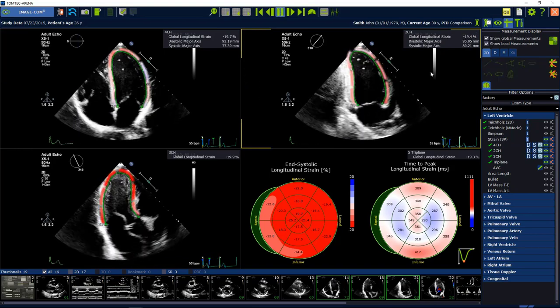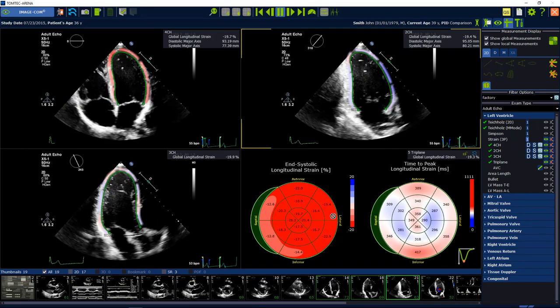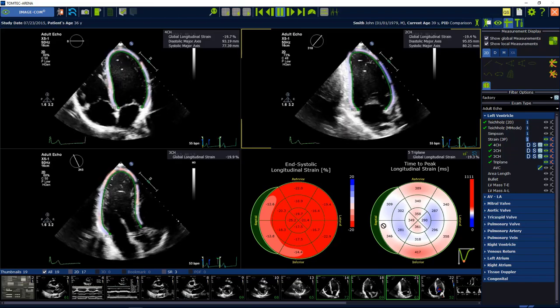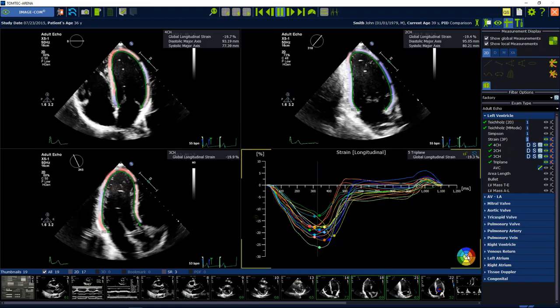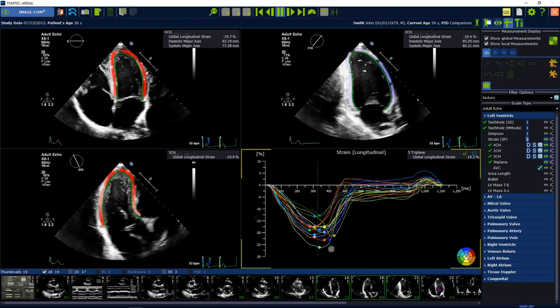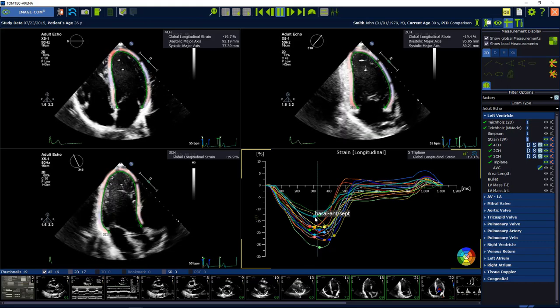The bull's-eye view will be displayed directly after the analysis. Select the segmental analysis button to visualize the longitudinal strain curves based on 16 segments.